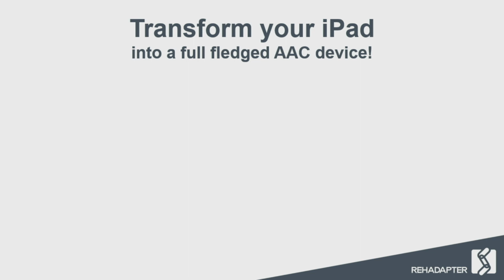So who of you is using iPads? How important are they for your daily routines, for communication, to access social media? My history was, I think 12 years ago, I was working for a German AAC company, and somebody told me iPads will never be used as an AAC device. They are always consumer electronic solutions. But they are so lightweight, and these different kinds of apps offer so many opportunities for customers all over the world. So I think everybody will agree that iPads as AAC devices are no longer something that nobody thinks they could use in this field.